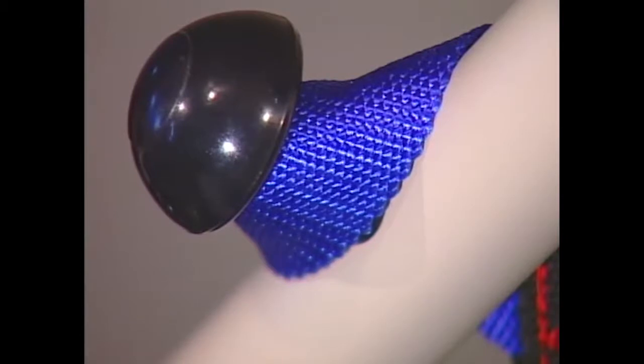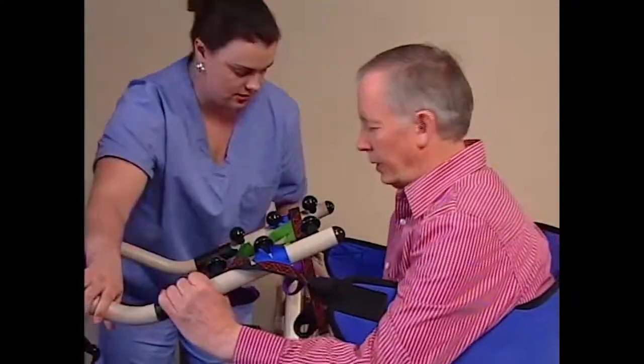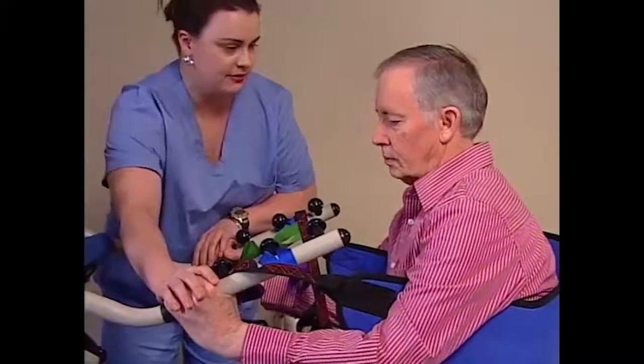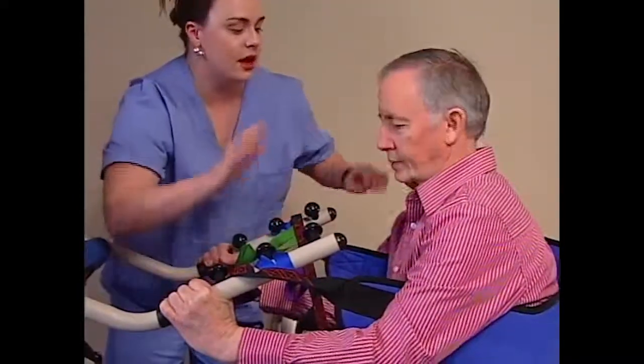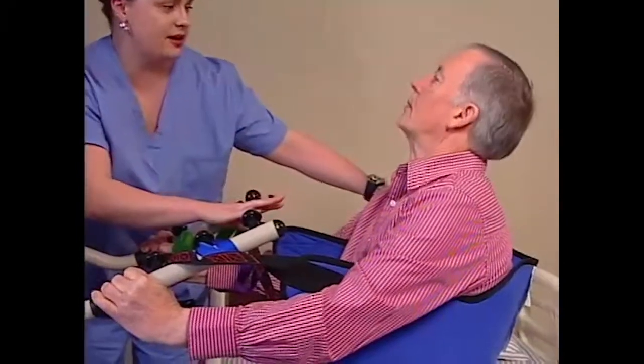They must be attached so they rest flush against the attachment spindle and clear of the attachment knob. Instruct the resident to hold on to the hand grips on both sides of the lift, relax, and to lean back into the sling. The resident can now be transferred.